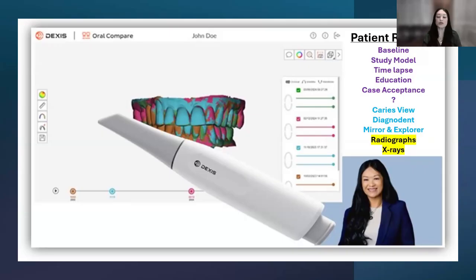We had the Diagnodent, which was a little probe that also had a little bit of a red light. We put it on top of the occlusal table. It would make all kinds of noises. And according to the range, it was a suspect whether there was some decay in that tooth. The whole point is that these three things that we utilized in our tool belt were for what? To be able to diagnose our patient and say, we need to take an x-ray, and this is the reason why.